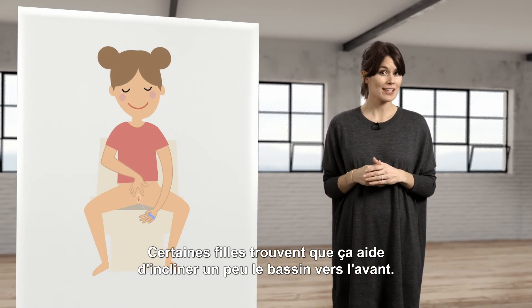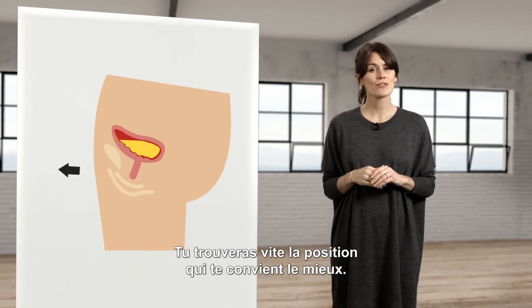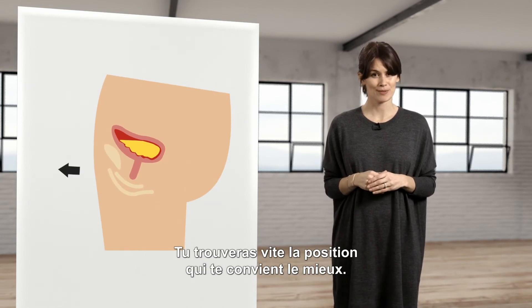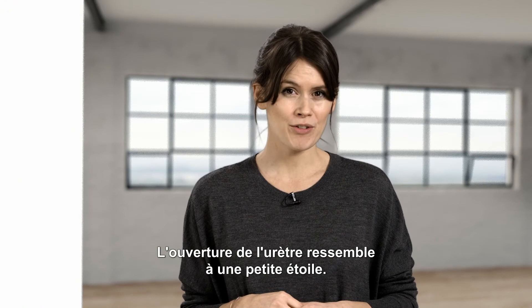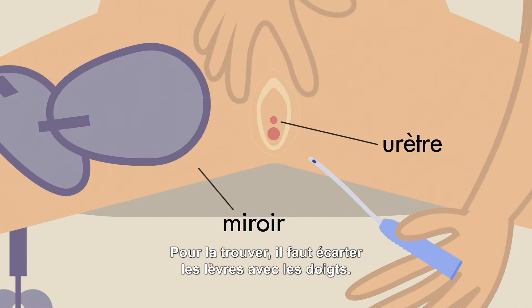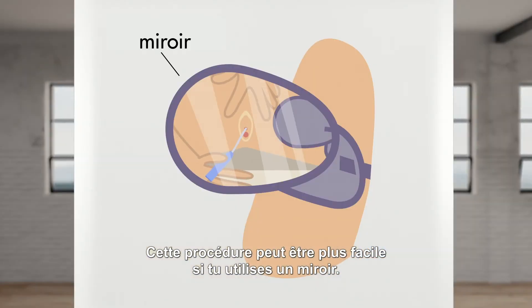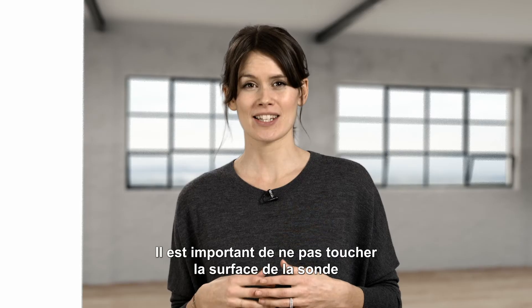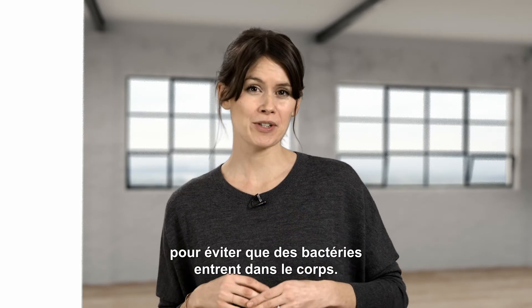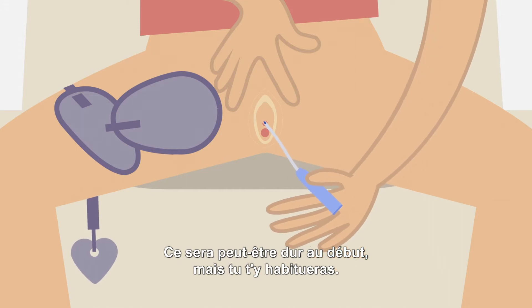Some women and girls find it helpful to tilt their pelvis a bit forward. You will soon find the position that works best for you. The opening of the urethra looks like a little star. To find it you have to spread the opening with your fingers. This procedure can be easier if you use a mirror. It is important not to touch the catheter surface to avoid bacteria going into the body. It may feel a bit odd at the start, but you will soon get used to it.